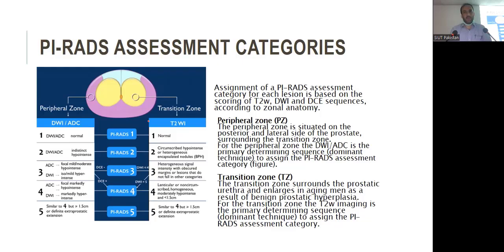That is due to the software not being available, so we are not doing detailed reporting of PI-RADS, because it is important to have a diffusion sequence, and dynamic contrast is also sometimes important, which can also increase the yield. So on this machine we are unable to report PI-RADS, though it could be reported.